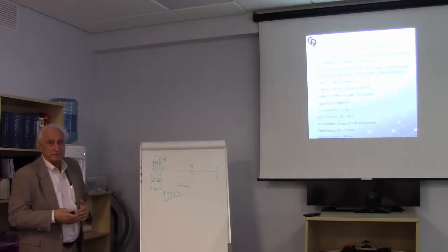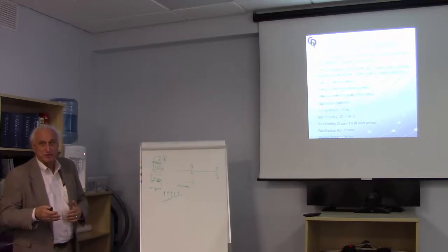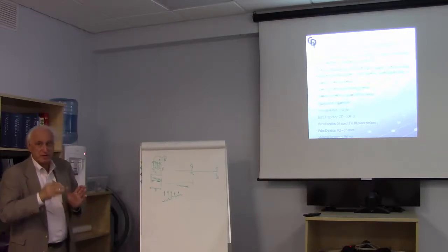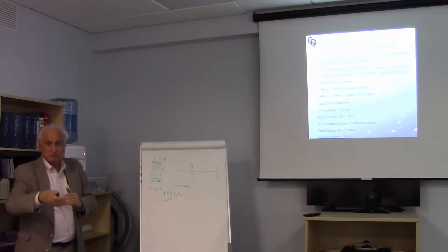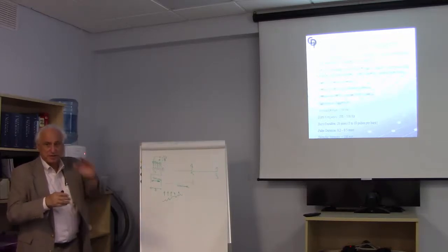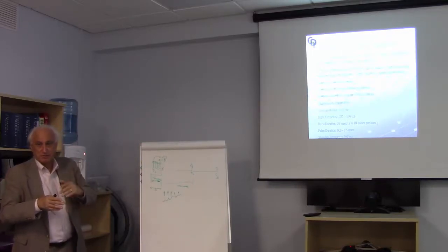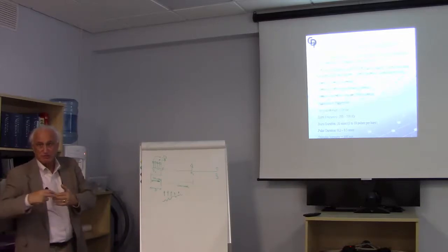We never go wider than 0.5 milliseconds. Some people will try to go wider. There's an issue there. If you think about the amount of charge being transferred to the patient, the number of electrons, the number of charged particles, it's the product of the amplitude and the width. Remember, milliamps is actually a number of electrons being transferred, and so the amplitude and the width tell you the total number of electrons being transferred.